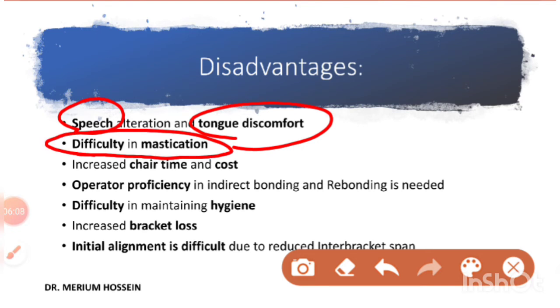Now, this procedure of lingual orthodontics is very technique sensitive, because everything you're doing is to be done in an indirect way. Like you're going to do everything in indirect vision. So due to that, it is going to increase the chair time, and it is also going to increase the operator proficiency required. You need a lot of skill to do that. And as a result of this, it is going to lead to increased cost, so it is going to be expensive.